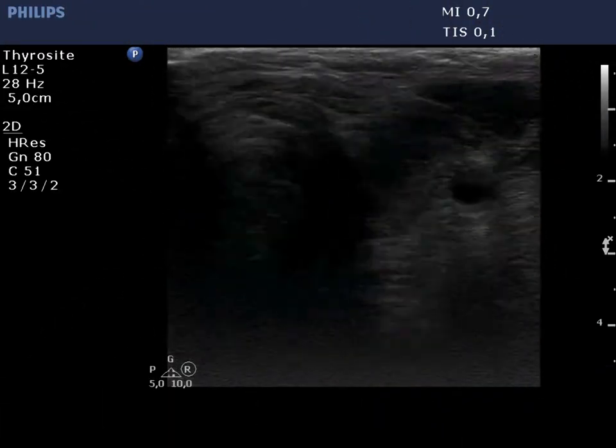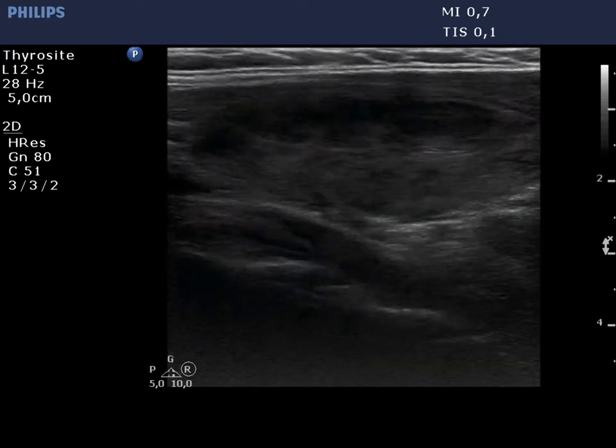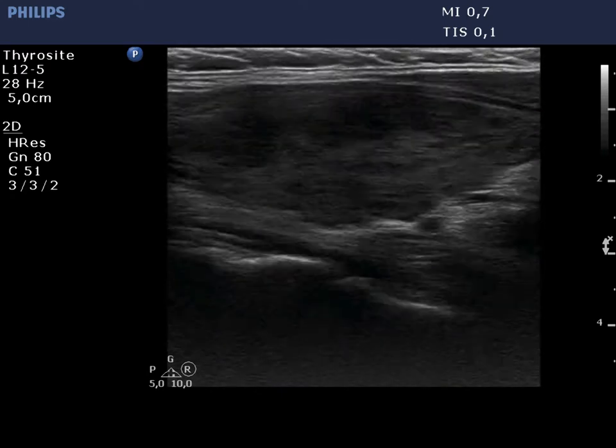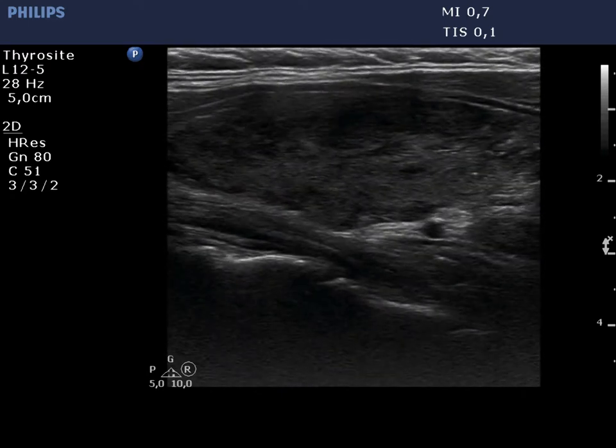The left lobe is moderately hypochogenic and also has discrete, more hypochogenic areas.